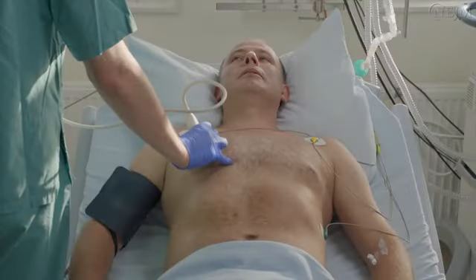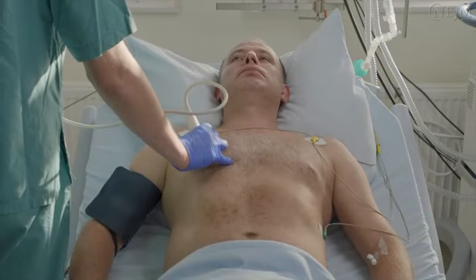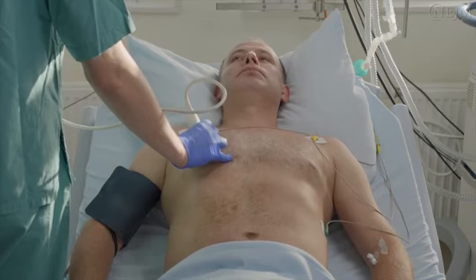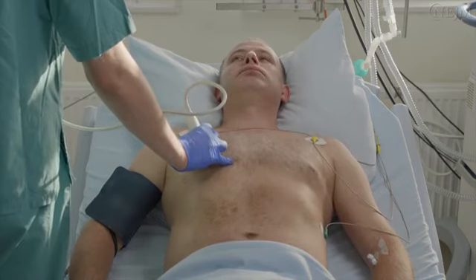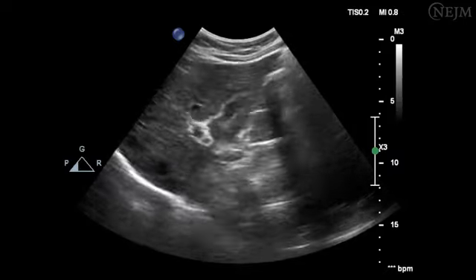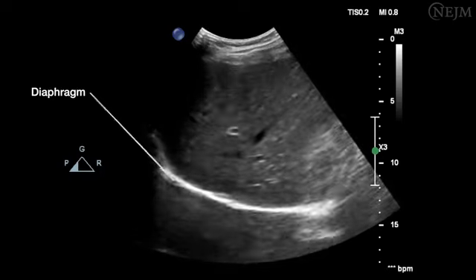An exacerbation of COPD or asthma can be triggered by a number of factors. In a patient with dyspnea who has a normal lung image, the exclusion of other pathologic conditions may point the final diagnosis toward exacerbation of COPD or asthma. Obstruction can be diagnosed on ultrasonography by assessing the respiratory movements of the diaphragm.